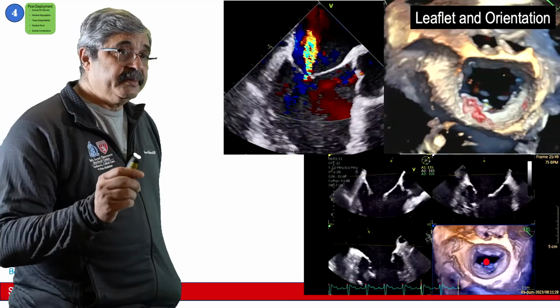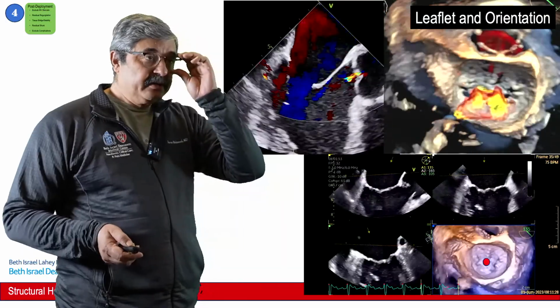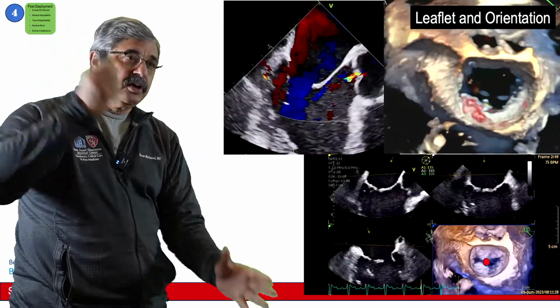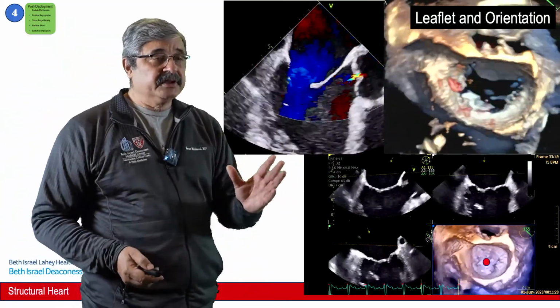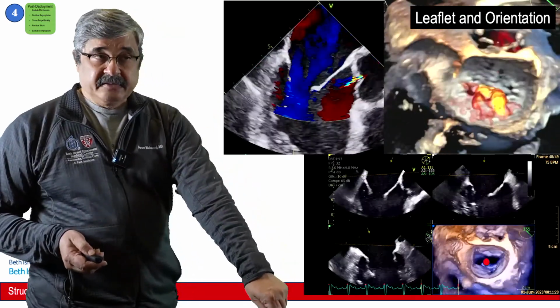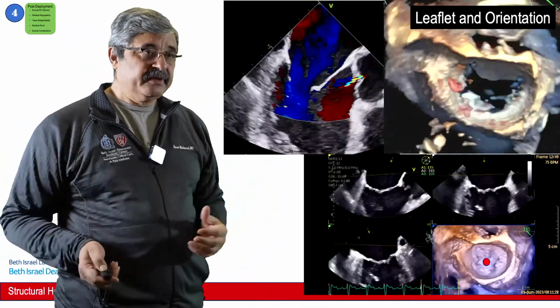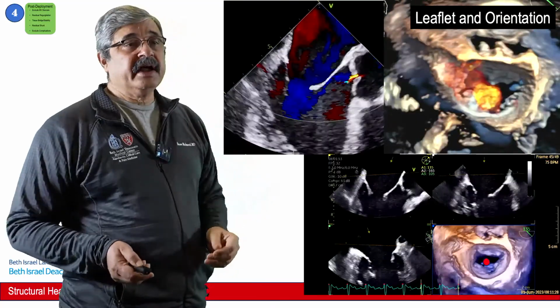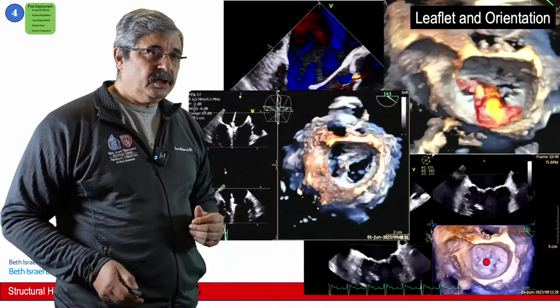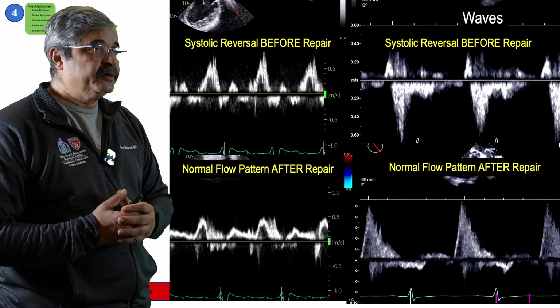Then come the leaflets and the targets. You want to show by 3-dimensional echocardiography that the target wasn't missed. If you have grasp and there's significant reduction, that reduction in MR must not be because the clip is still attached to the steerable sheath. The moment you let the clip go, there could be significant mitral regurgitation. You have to be certain that this reduction in MR is not because you're holding the clip there. As soon as you let go and deploy the clip permanently, that's the point where you want to look at the leaflets to confirm you have not missed your target. Again, you use 2-dimensional as well as 3-dimensional echocardiography to ensure that.